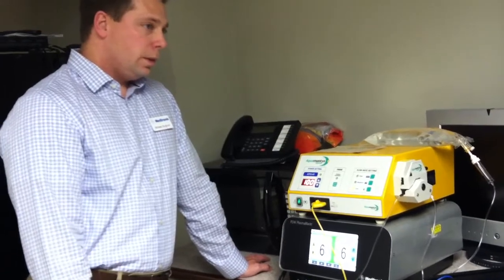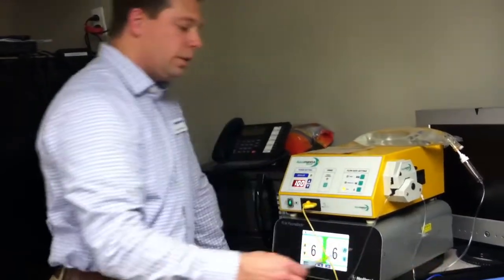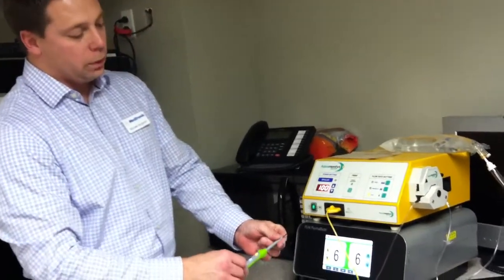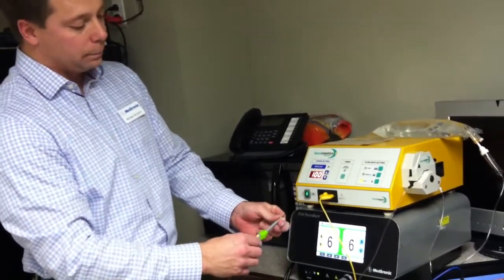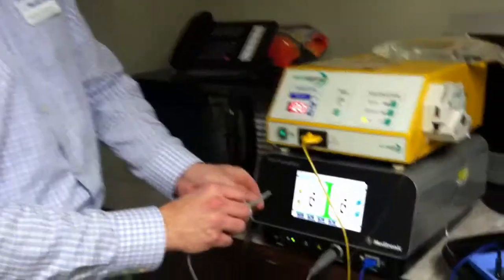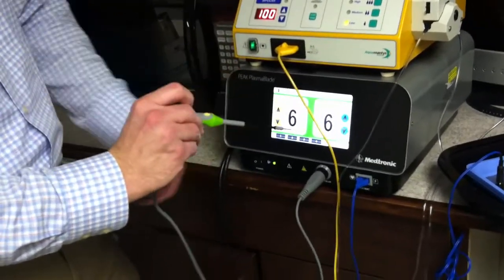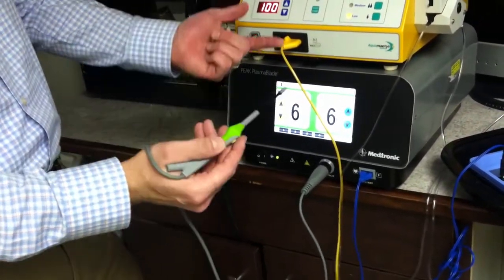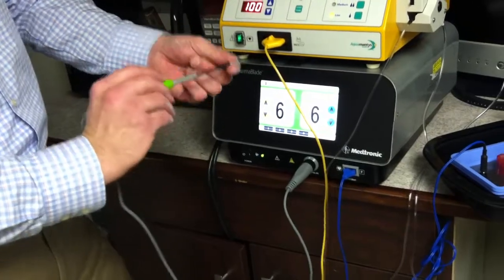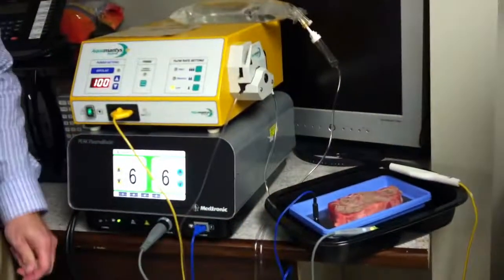Shoot for both devices then? Yeah, definitely. I like the blade. We have a different iteration of this. This one's pretty cool because it's a smaller blade. There's one called a 4.0. It looks quite a bit like a standard Bovie. The tip is malleable and it's got a larger footprint. It doesn't have all the bells and whistles like this, and it doesn't have suction on it. This thing produces less smoke anyway. But if you like this one, I like that. I'd like to just give you some options. That sounds good.